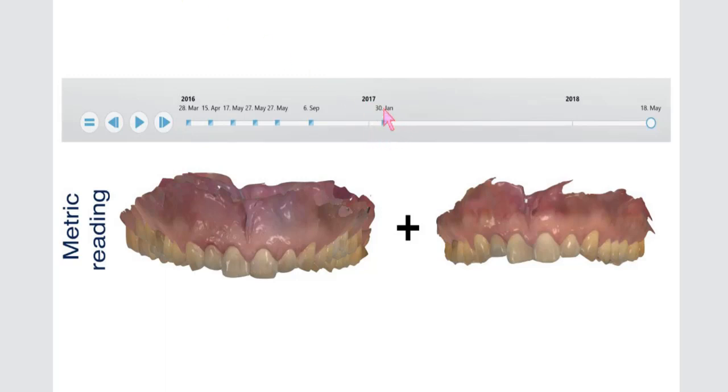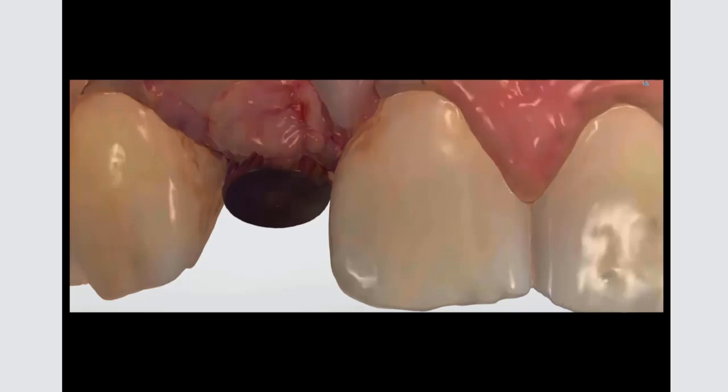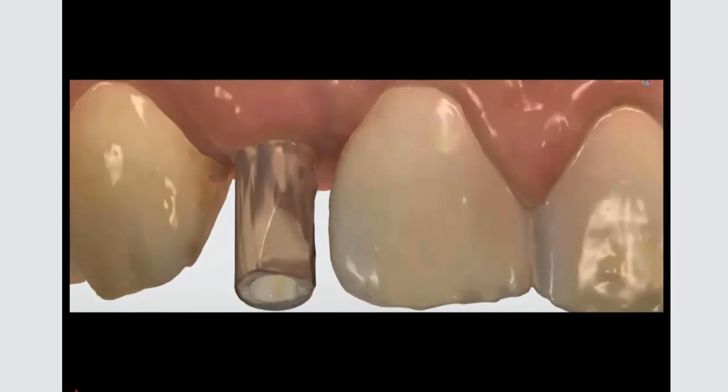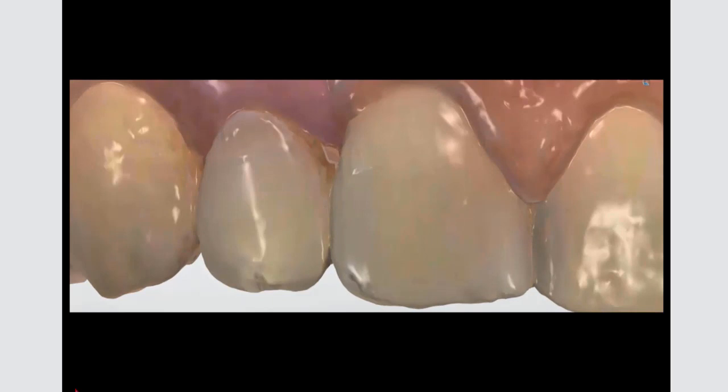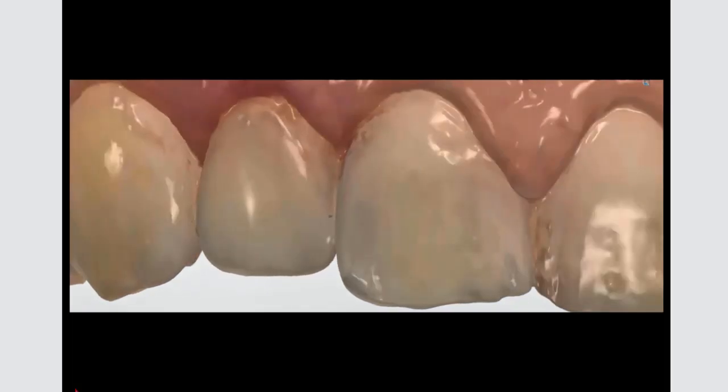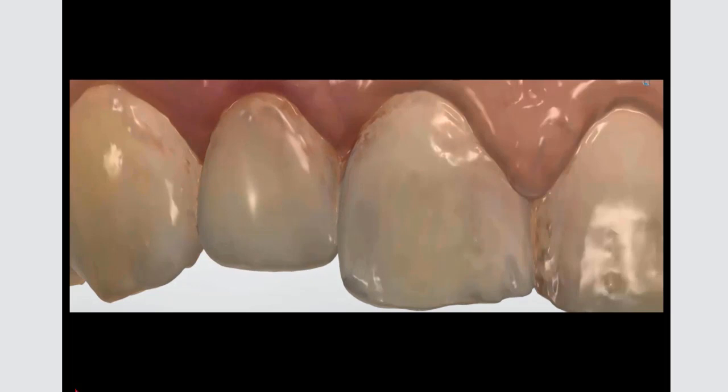I finished the treatment of this patient in January 2017. And now in May, after 1 year and a couple of months, I scanned him again just to see how this graft area has performed. So let's see what we can extract from that. Here is a very nice video of the whole process of overlaying scans, as you can appreciate here. This is the 6 scans overlaid in a video, and then even in the temporary that is a little longer, when I match the tooth dimensions, here is the discrepancy.